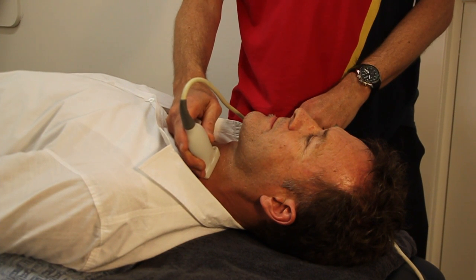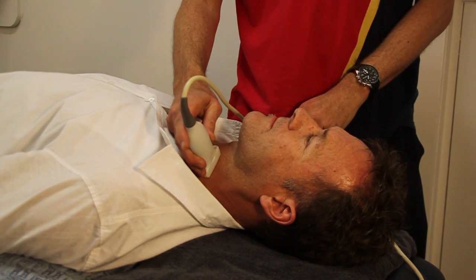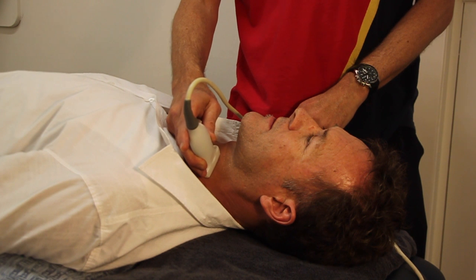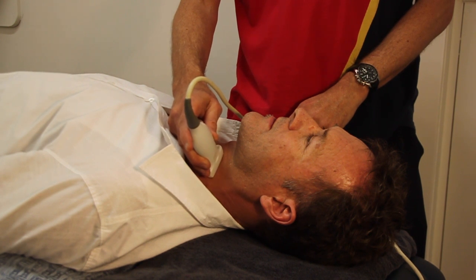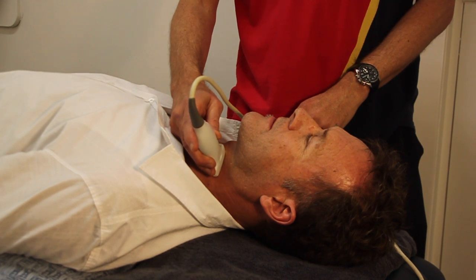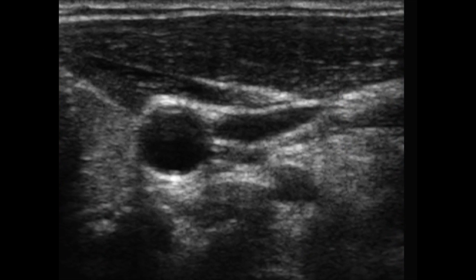To obtain an axial image of the longus colli, scan the neck in a transverse plane just lateral to the trachea with the patient lying supine with no pillow. Image the thyroid lobe at the lateral edge of the trachea. The pulsatile carotid artery will be seen further lateral to this, with the longus colli visualized beneath it.